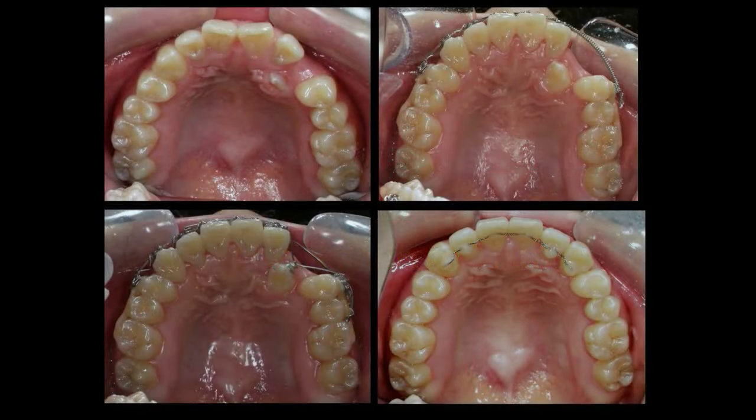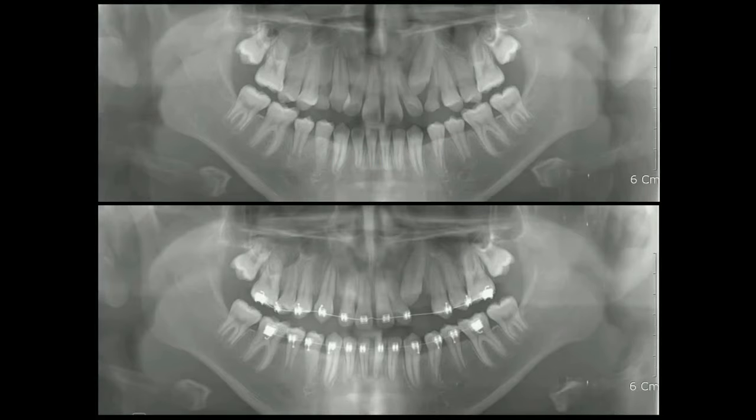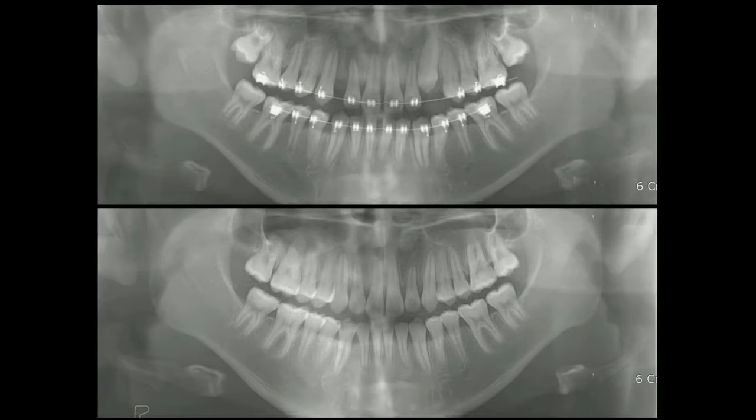To avoid canting of occlusal plane, stabilizing the rest of the arch with rigid wire and overlay wire is indicated. The cant of occlusal plane was maintained by rigid stabilizing arch wire. The best solution would be just to open up the space and wait for spontaneous eruption. I have done nothing but open up the space and keep waiting. High canine erupted spontaneously without any vertical forces.